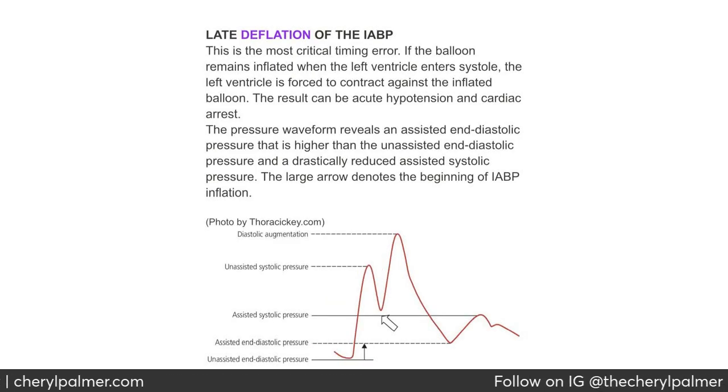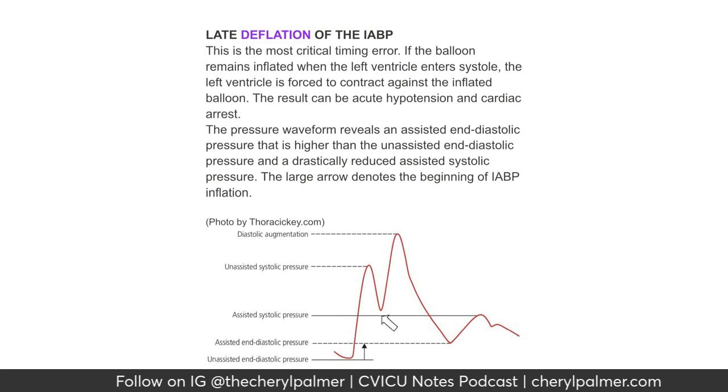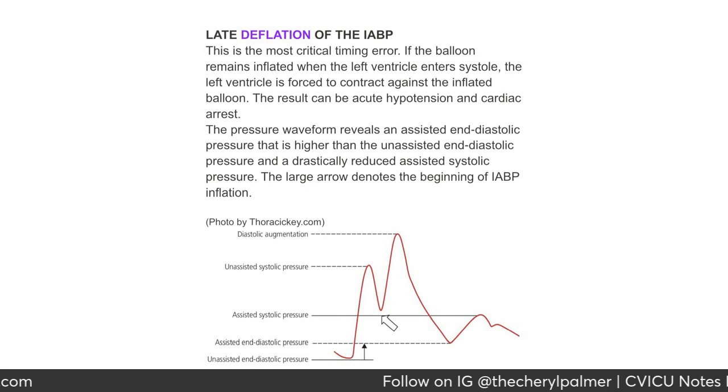Late deflation of the balloon pump. This is the most critical timing error. If the balloon remains inflated when the left ventricle enters systole, the left ventricle is forced to contract against the inflated balloon. The result can be acute hypotension and cardiac arrest.